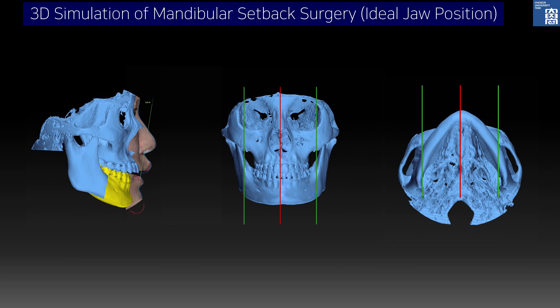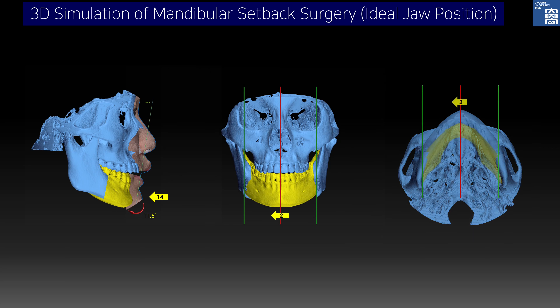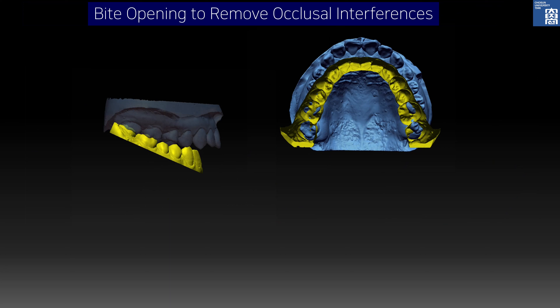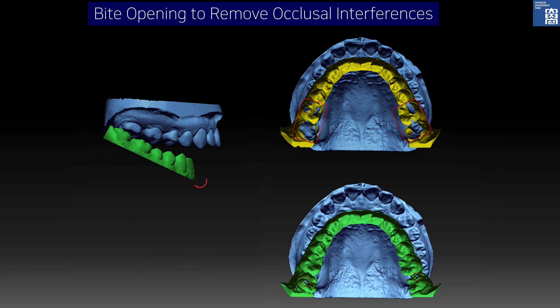3D simulation of single jaw surgery for the surgery-first approach. Yellow shows the distal segment of the mandible — this distal segment was set back and rotated backward. Distal segment was translated to the right. On the submental vertex view, mandibular symmetry was achieved with control of the yaw. At this ideal position of the mandible, there was overlap of molars. These overlaps were seen as perforations between maxillary and mandibular molars. To remove these premature contacts of molars, the distal segment was rotated backward.